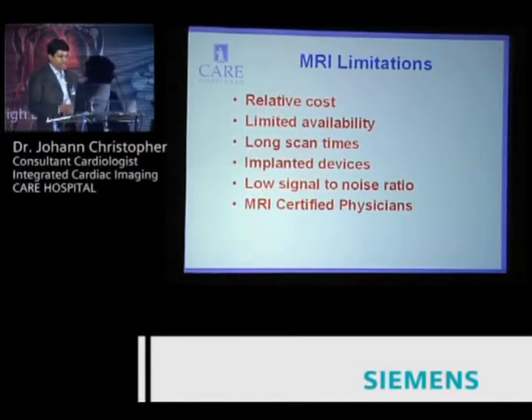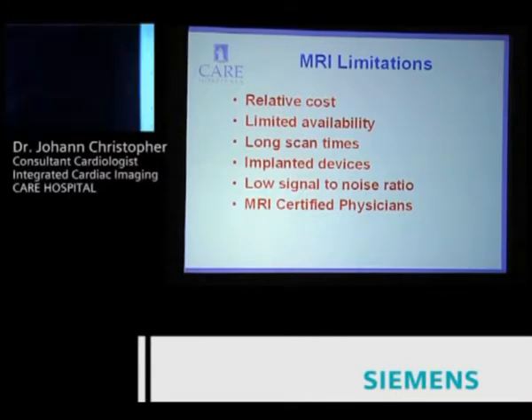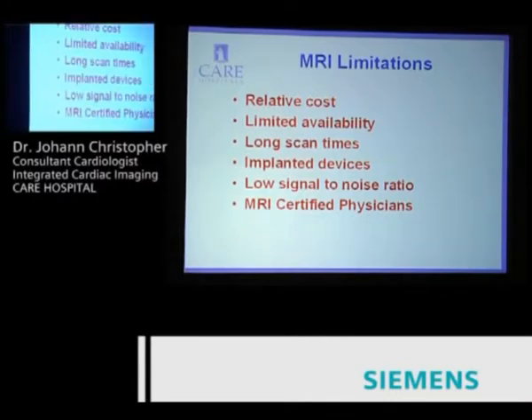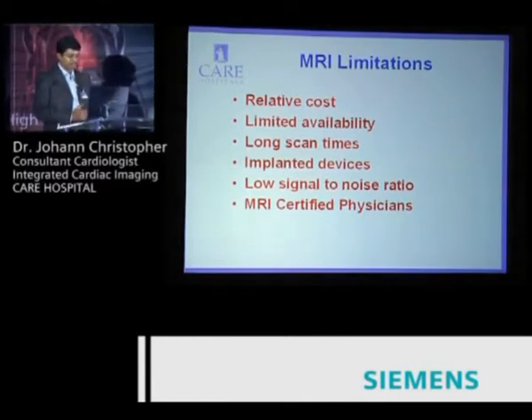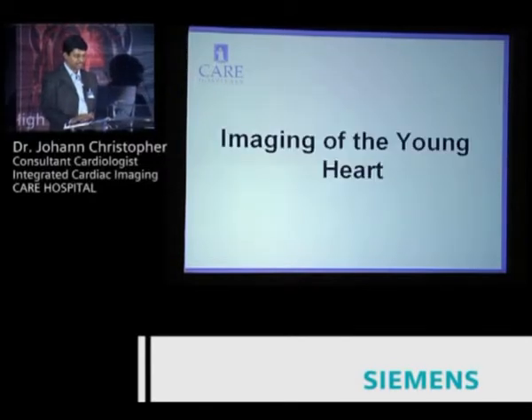Problems with MR, we all know the relative cost. Even at our own institution, MR is much costlier than CT, limited availability of MR scanners compared to CT, very long scan times, and this is something we've been having a problem because our children are very, very young, 2 month, 1 month, some are a few days old, and then it's very difficult to anesthetize them and keep them that way. Devices not a problem in this population, and certified physicians.